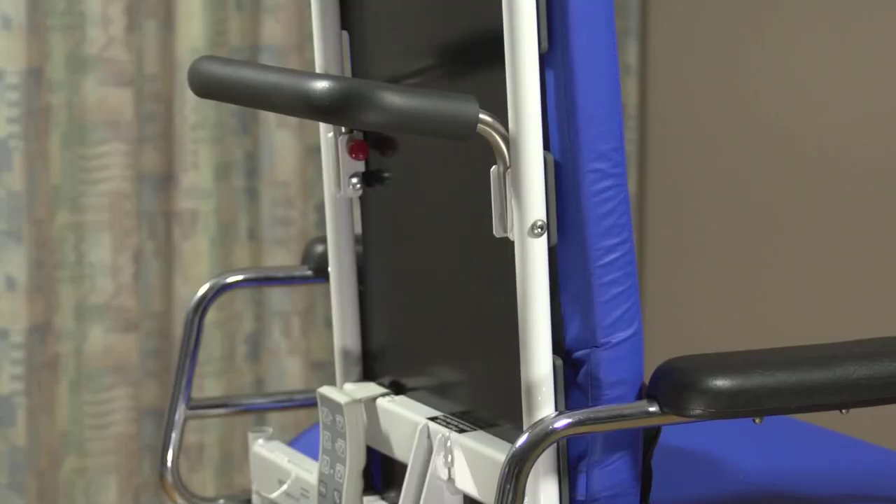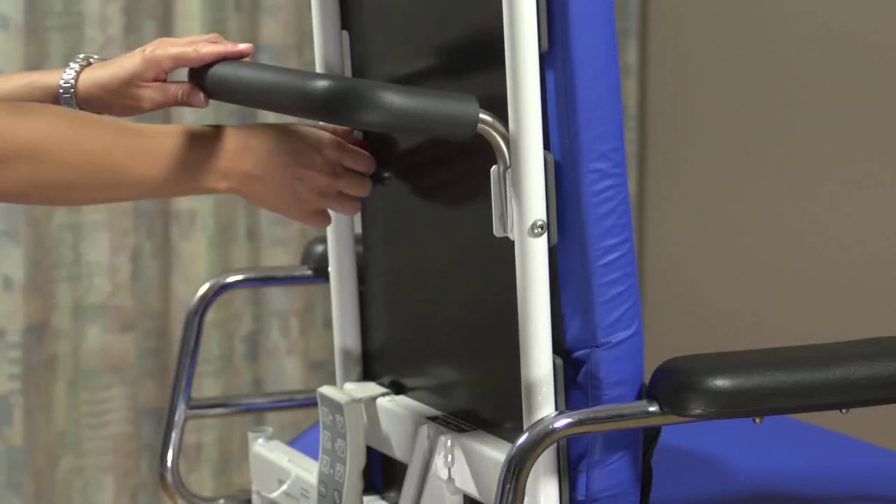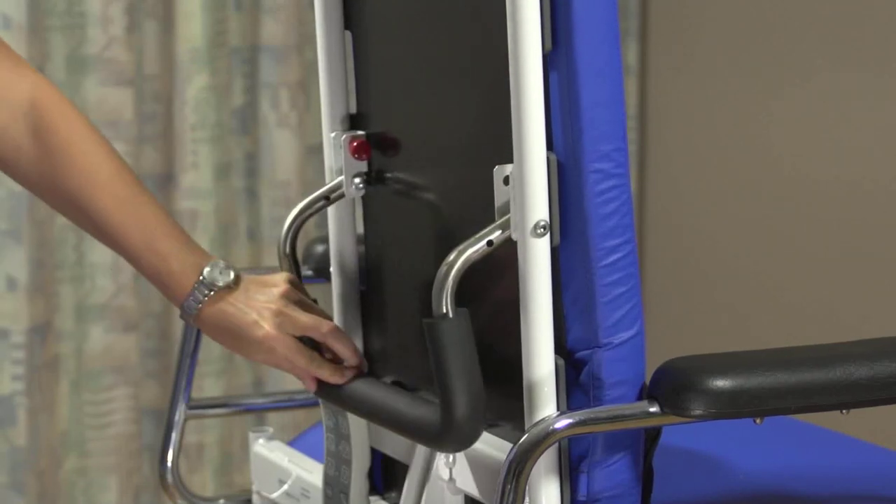The chair's push bar makes transport effortless. It can be released and lowered out of the way during procedures.